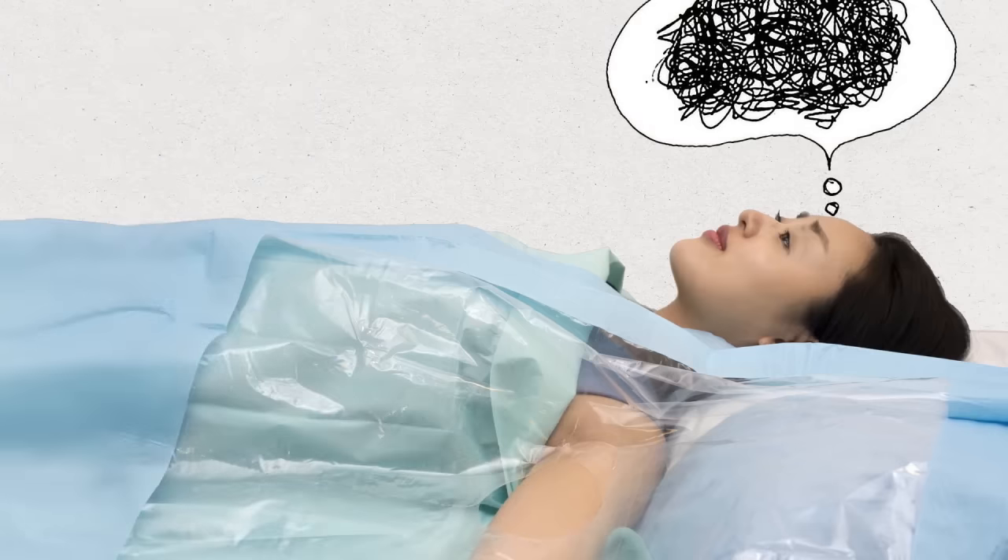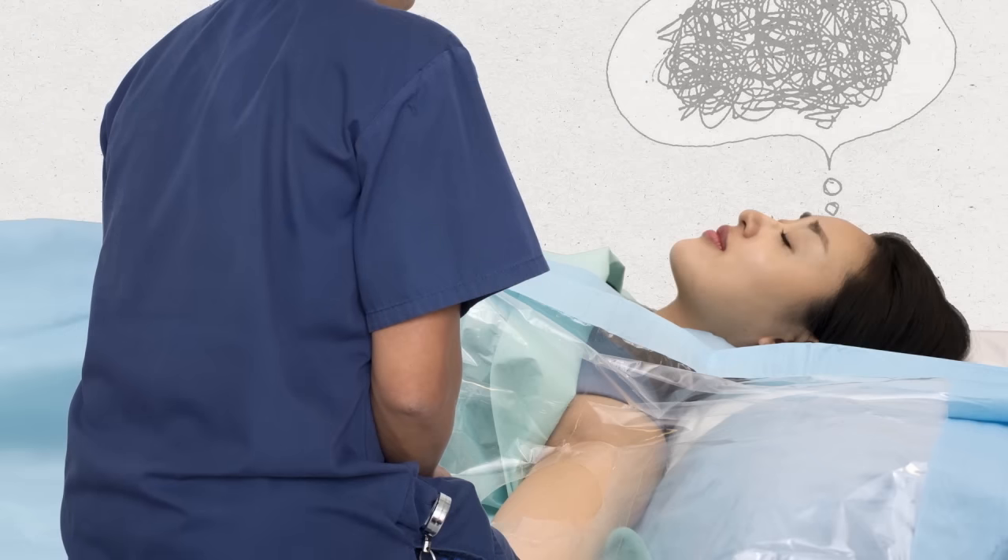Some people do feel anxious, even though the procedure is almost painless. You should talk to your nurse or doctor at any time if you're worried or feel uncomfortable.